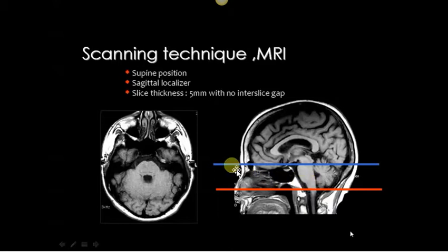Sometimes we get a special type of line, like you can see this blue line. If you see this blue line, the main thing is that it can show some special structures.